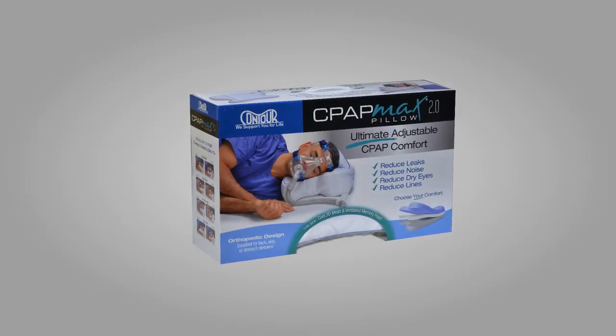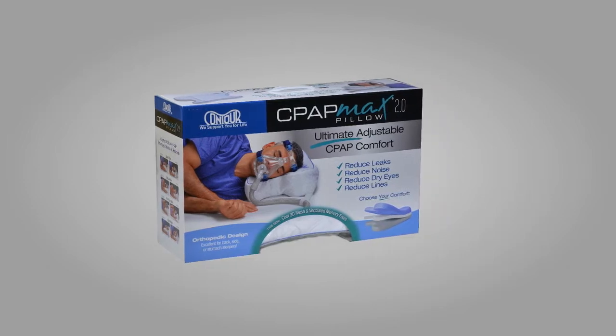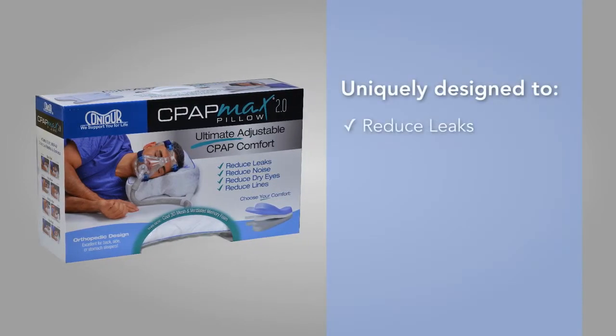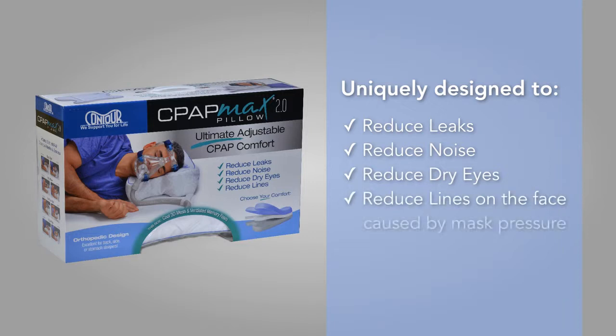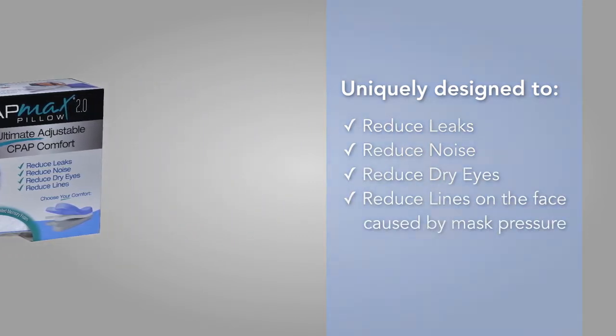This adjustable CPAP Comfort Pillow is uniquely designed to reduce leaks, noise, dry eyes, and lines on the face caused by pressure from the mask.